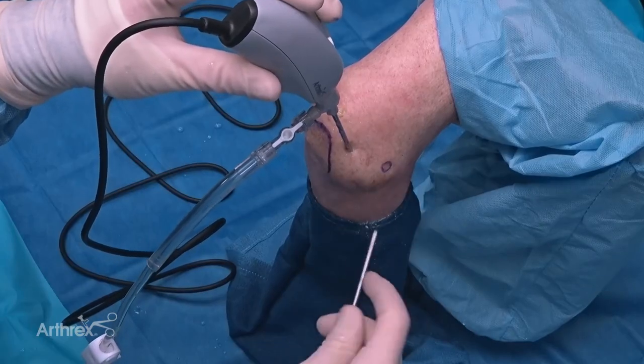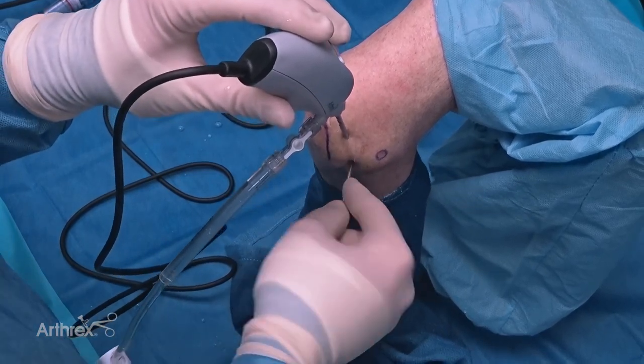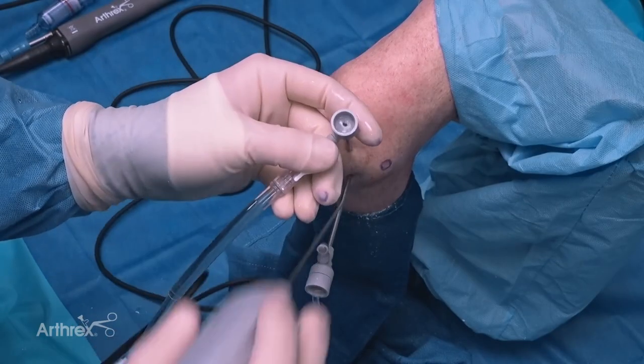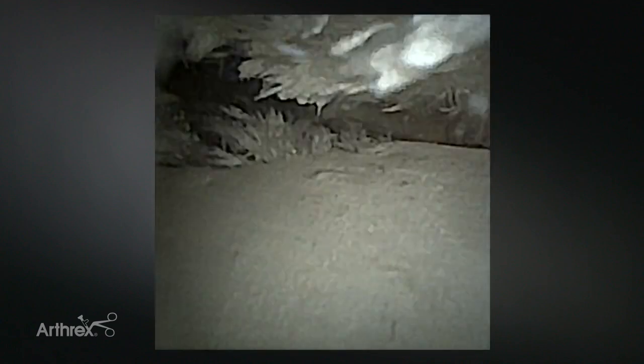Now I'm going to establish a soft spot portal - feel for the soft spot - and then create that portal without making an incision. I'll replace the camera. Now I'm looking at the radial head, which you can see rotate, and I'm going to take a view that we can't really do with a standard four millimeter scope - I'm actually going to look across the radial capitellar joint and drive across this joint.